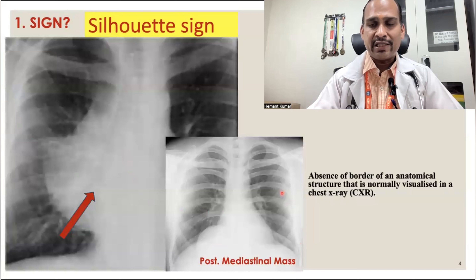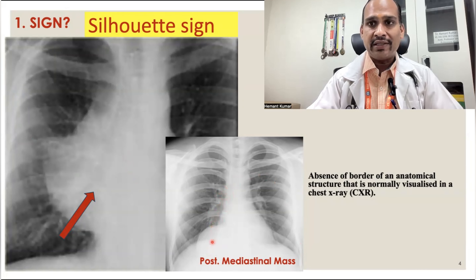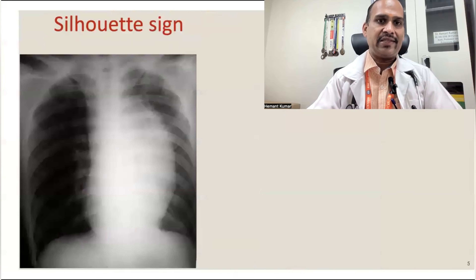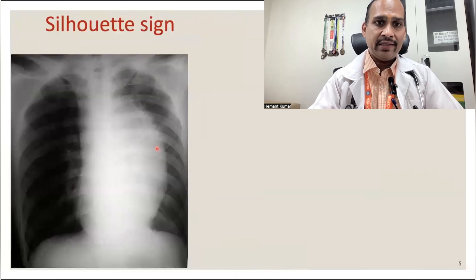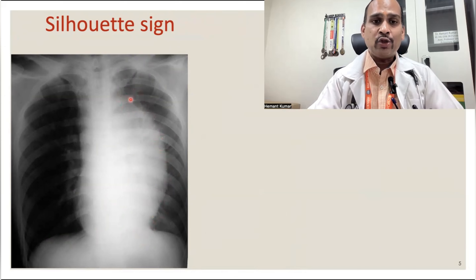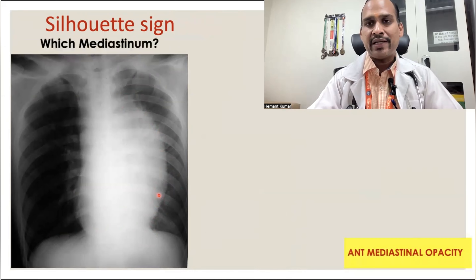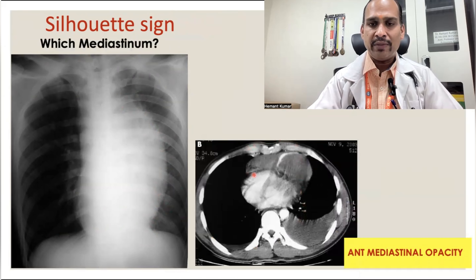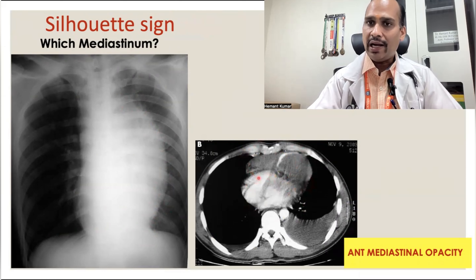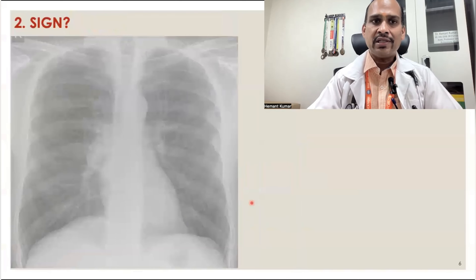That second example is a posterior mediastinum mass. Any opacity which obscures the right heart border is anterior mediastinum. You can also see another opacity where you cannot make out the left heart border — any opacity obscuring the left heart border is anterior mediastinum. On CT scan, you can appreciate this opacity in the anterior mediastinum, in front of the heart. That's about the Silhouette sign.